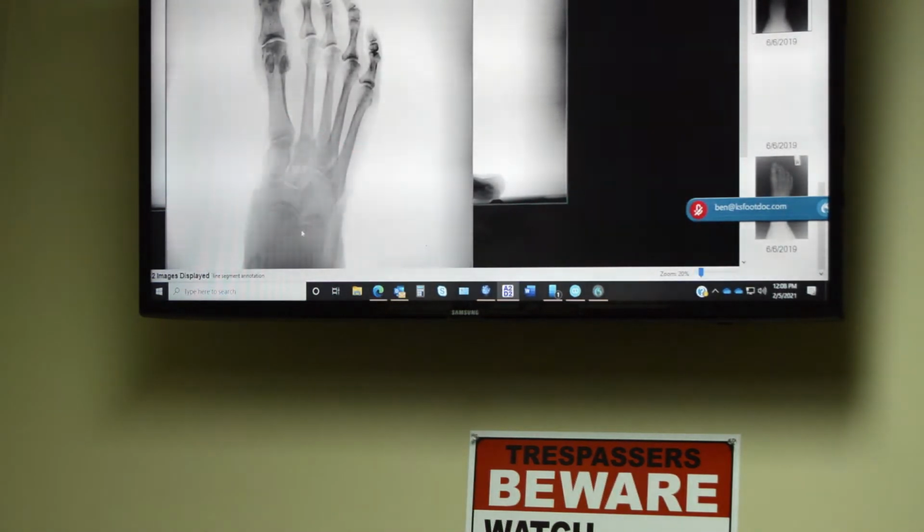So if we look at the anterior to posterior view, one of the big things I look at, the talus, this bone right here. If again we are to bisect that bone, you'll notice that we deviate to the big toe by quite a bit. The angulation of the talus should line up between the first and second toe. You can see that there's quite a variance going on here. When this talus internally rotates or goes outside the big toe, that's what's called pronation.